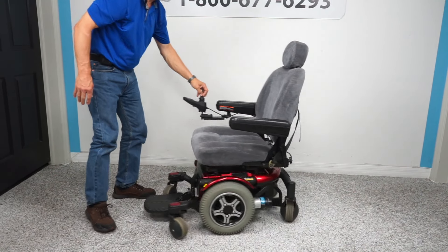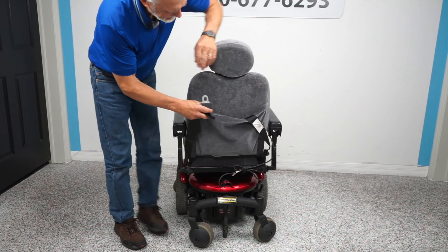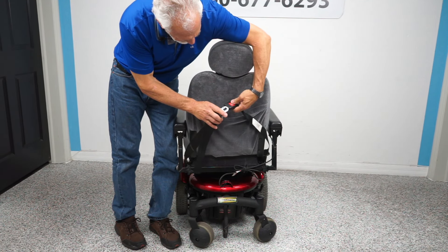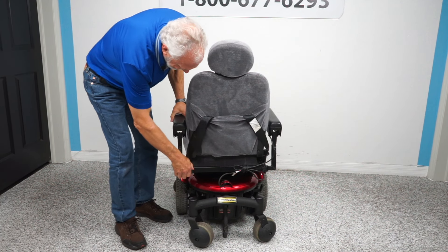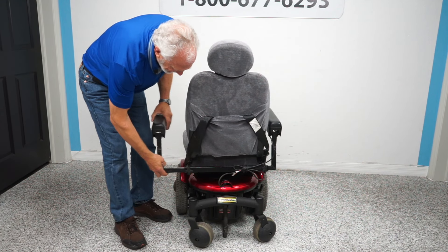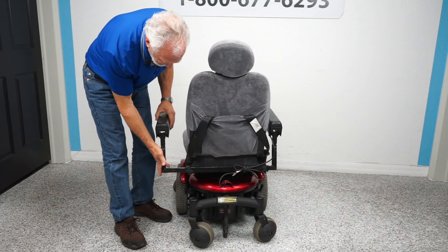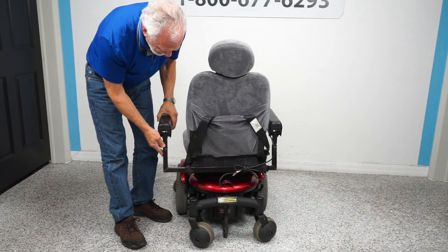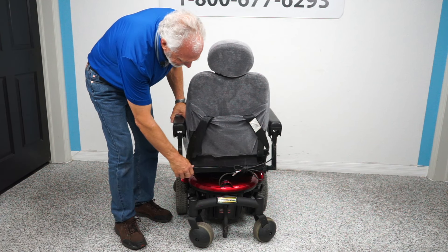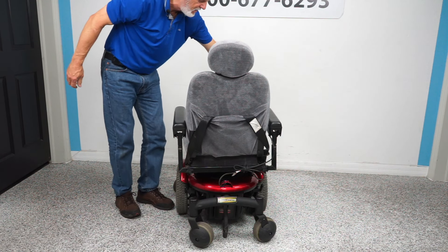The back of the chair has your safety belt, which is back here. The arms on this chair — if you want more width and more height, you can adjust them through these little screws right here. You can add height to your arms.